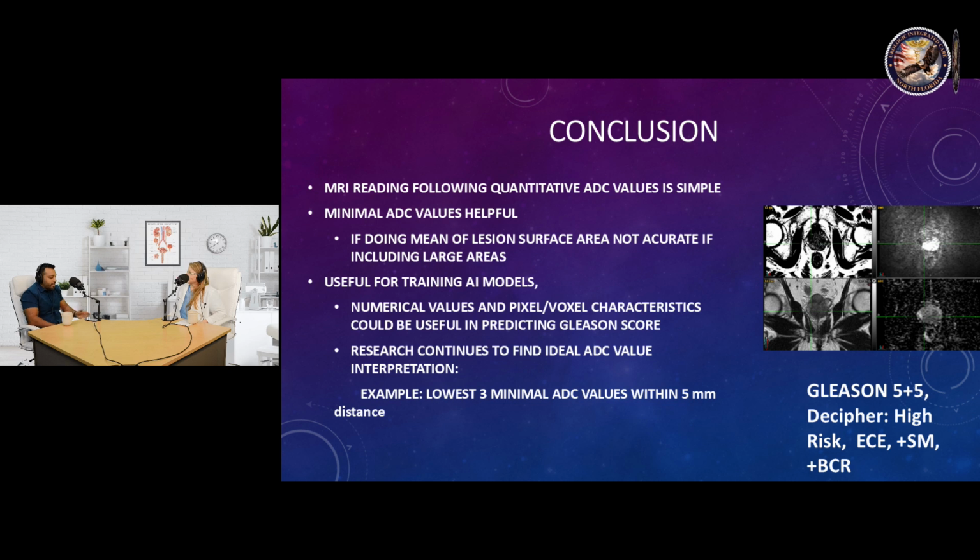What I've realized working with people like yourself is that you are just busy. We talked about this like a year ago, so I don't know if you remember. I do, I absolutely remember this. You plot all your ADC values and you look at the bell curve, and you look further down the bell curve. Exactly.